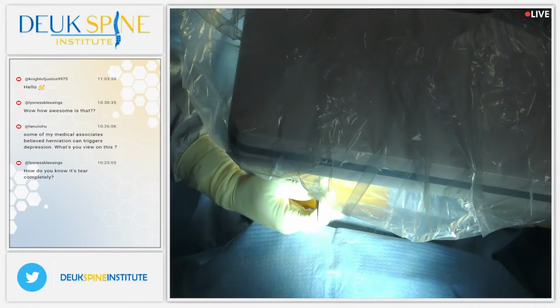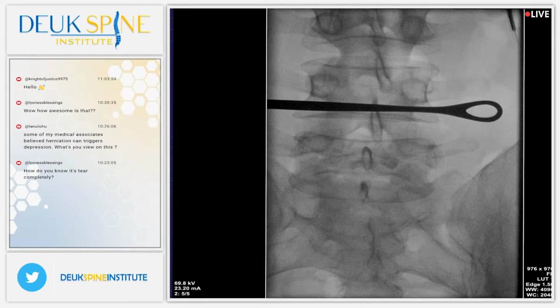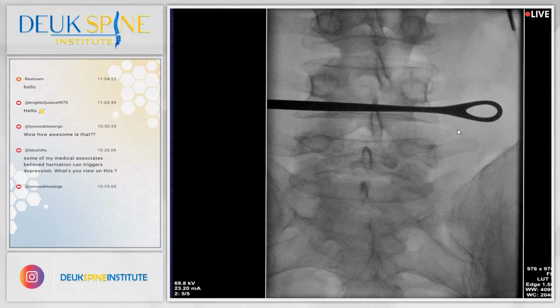Shot right there. Before you do that, injection. Take your knife away. And let's look at the anatomy. All right, so Jordan, show the audience, take a shot, show them the anatomy.